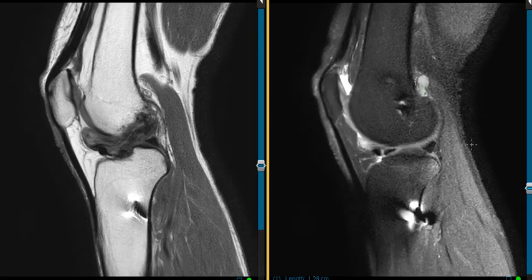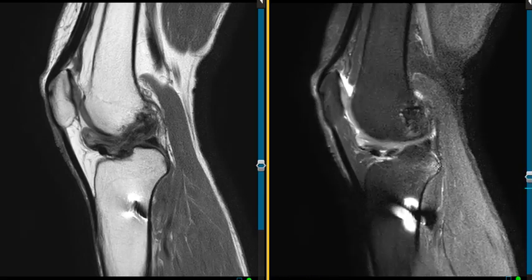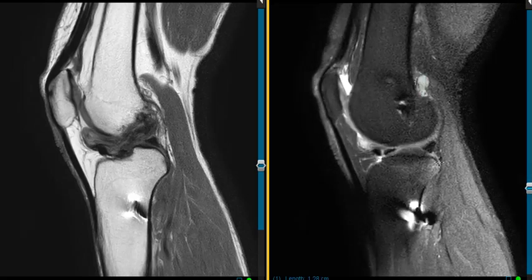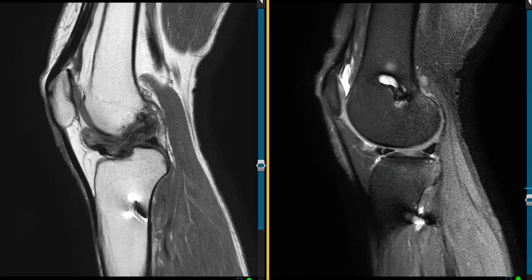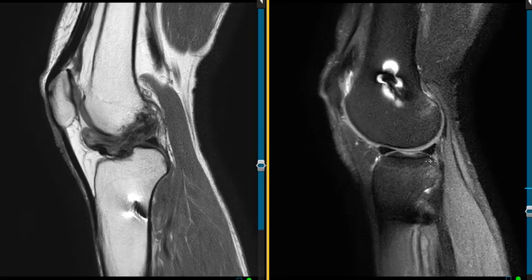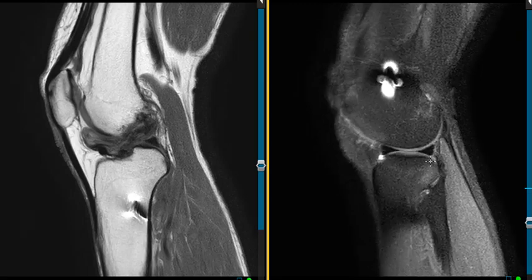He did have just a minor bone bruise back here in the back of the tibia. This may even have been from a prior injury, and maybe some residual marrow edema, but really nothing all that significant.